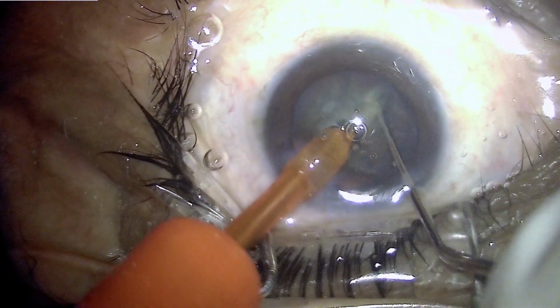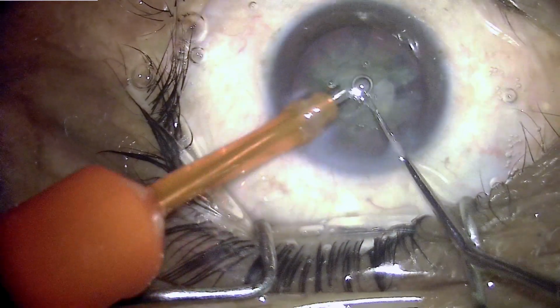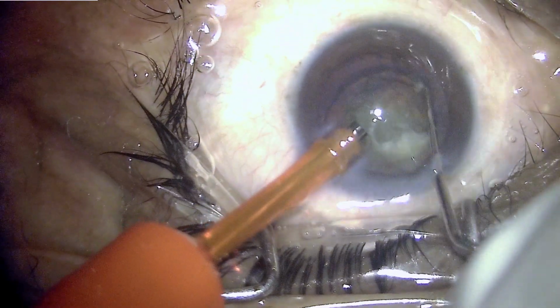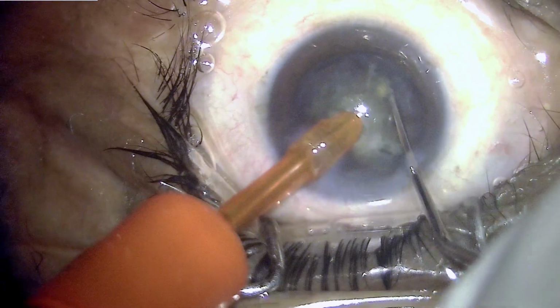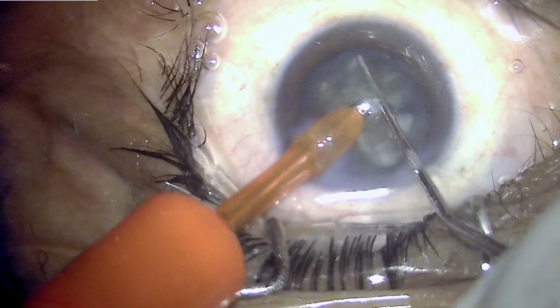And as we can see, there is a significant nuclear sclerosis, and we are going for a direct horizontal chop. The chop has been created, and we can see the nucleus has been bisected into two, which is such a satisfying event when you are doing such cataracts, because one single chop which is successful is key to the further eventless surgery.